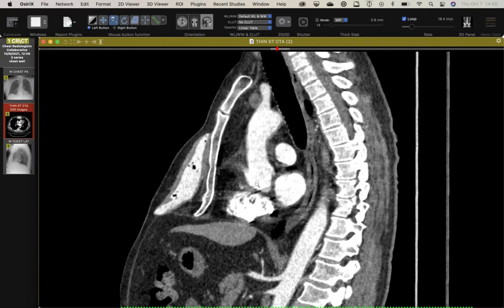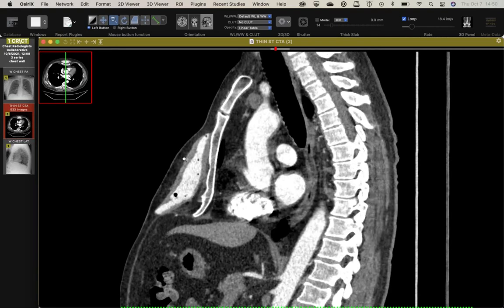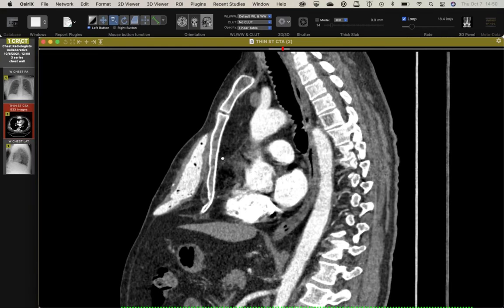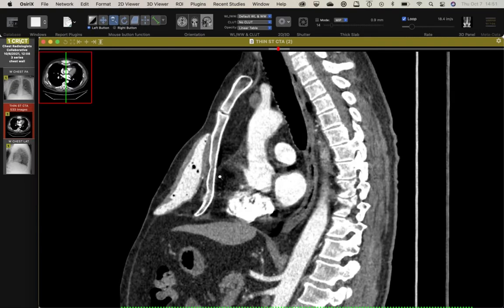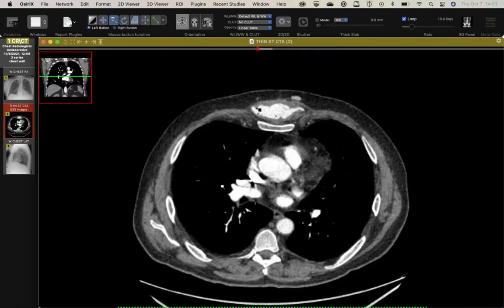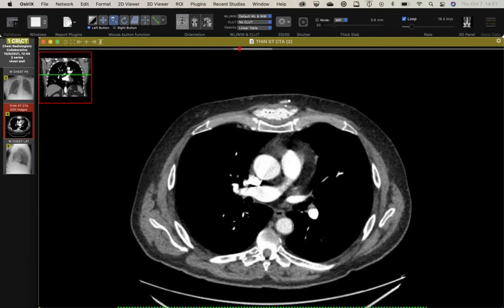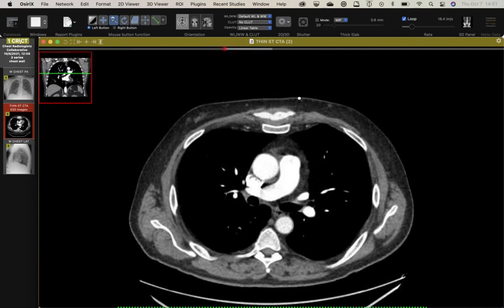But there is a body of literature using silicone implants and silicone injections to fix the cosmetic defect. It doesn't fix the deformity. And you can see his pectus is pretty mild. It probably doesn't cause respiratory compromise that you may see in something like Marfan syndrome. But for cosmesis, in the plastic surgery literature, there were a couple papers talking about using silicone implants and silicone injections. It's really dense even for silicone, but there's this little thing here. It kind of looks like what we've seen when silicone leaks out. So I suspect that's what it is.